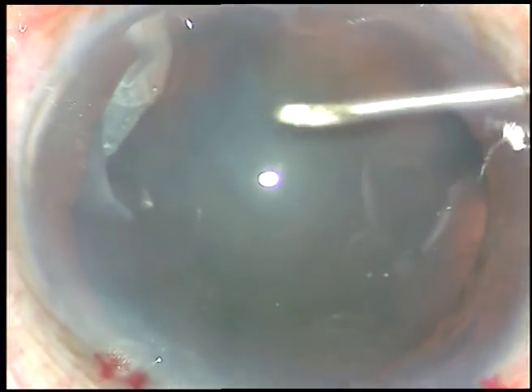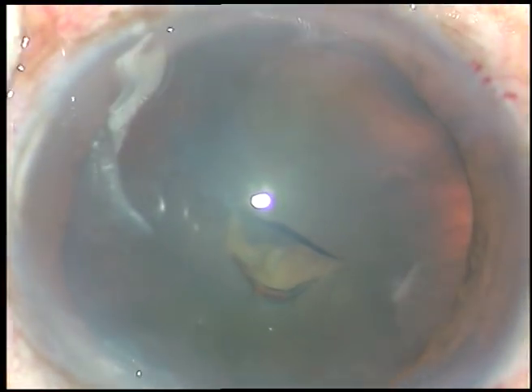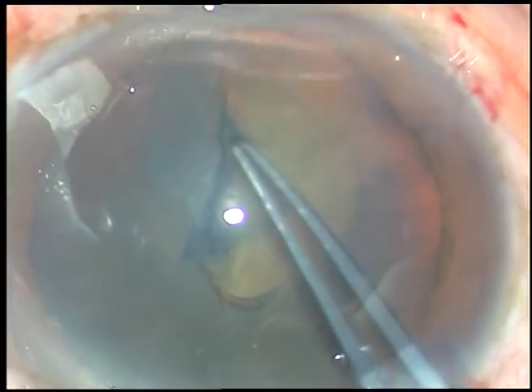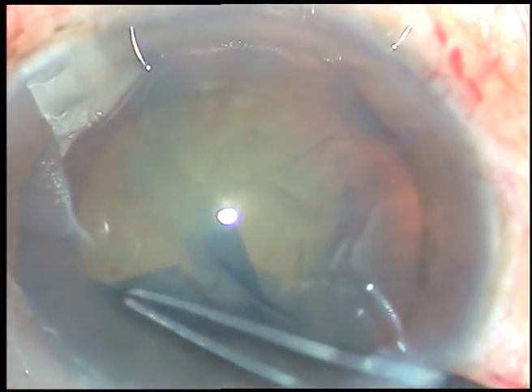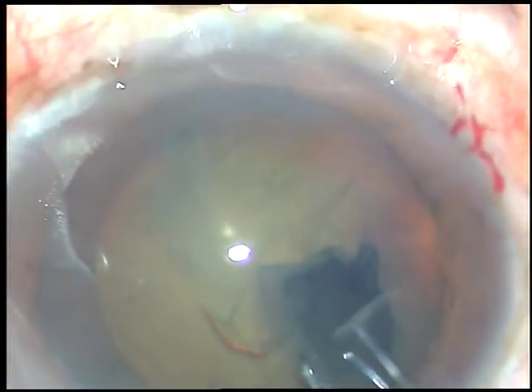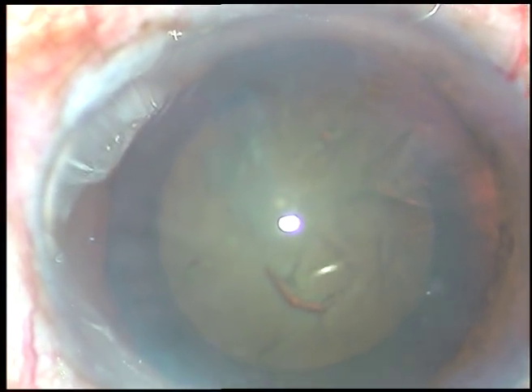With the 26-gauge needle I now use Utrata forceps to hold this tag, tear off the anterior capsule, and make an opening. This opening should be as round as possible. I try to remain at a certain distance away from the margin of the pupil, and thus I get this kind of round rhexis.